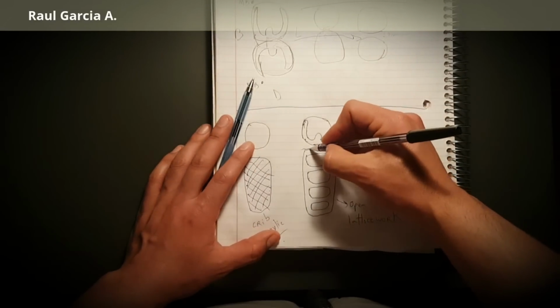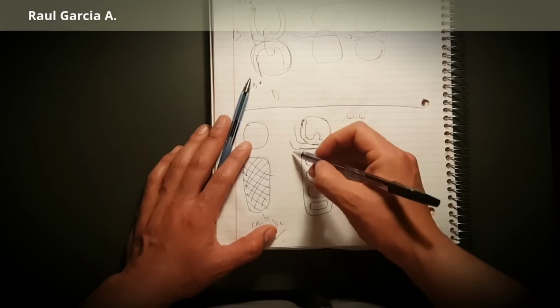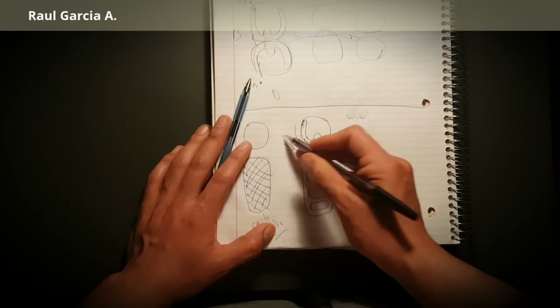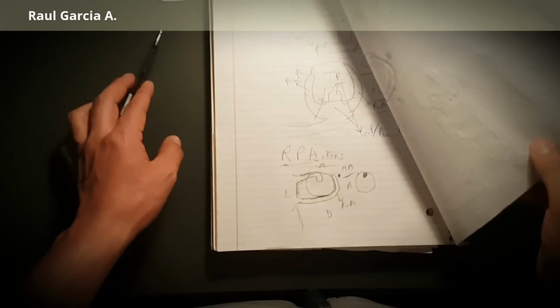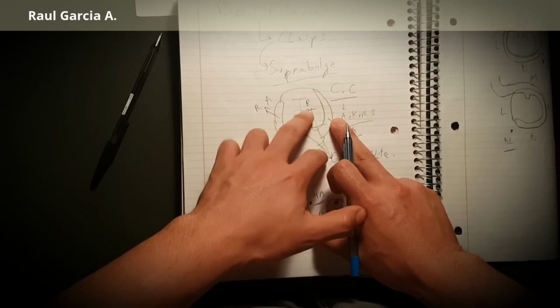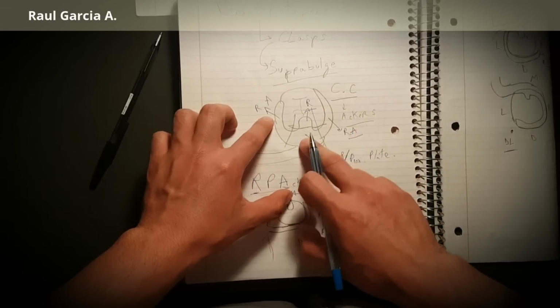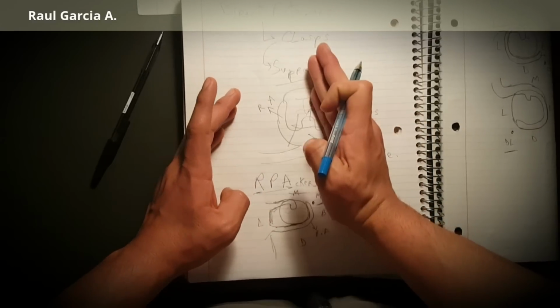Then it comes here and follows the rest of the structure, okay? The major connector. This is the minor connector. So, as I separated here, what were the parts? Retentive arm, rest, reciprocal arm, guiding plane. All together, what we do is that we just cut the retentive arm.